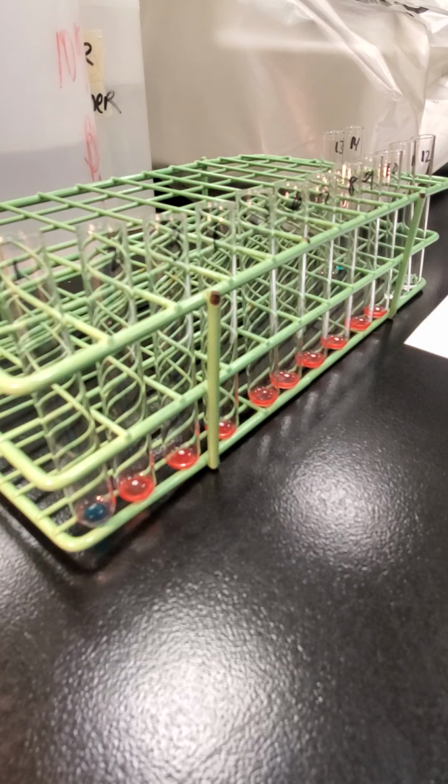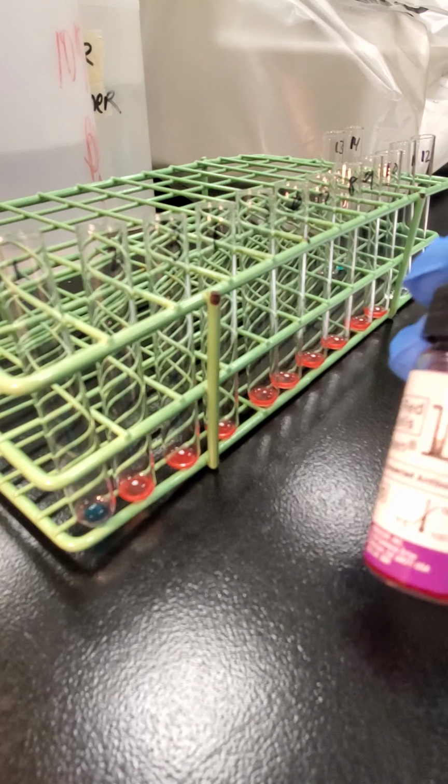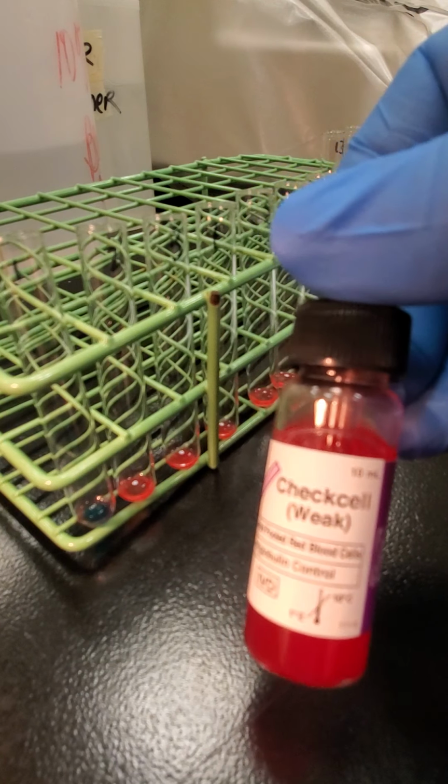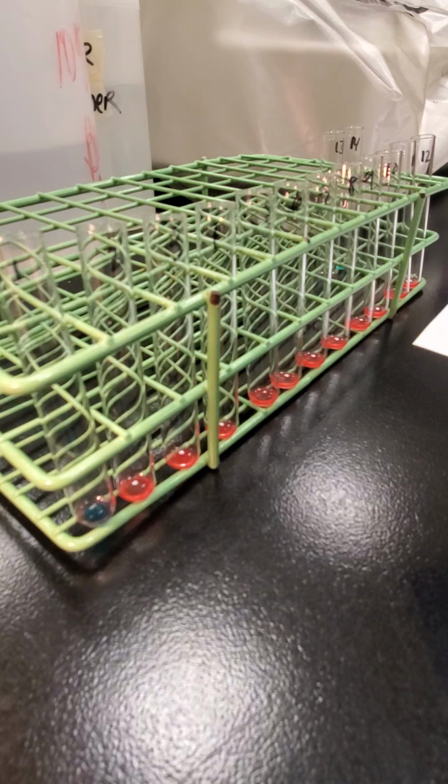Okay. Then to tube 11, we're going to add the screen cell 2. And then to tube 12, we're going to add screen cell 3. Okay, and then to tube 14, I'm going to add my check cells. Okay. So we've added all of our reagents and our QC kit reagents.